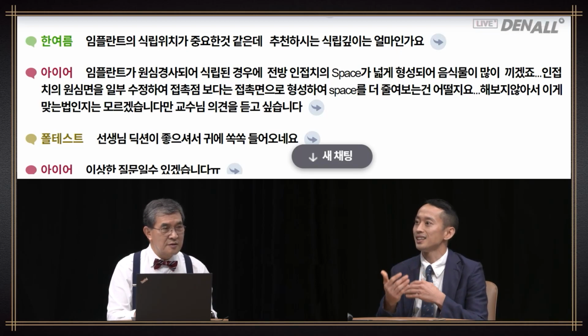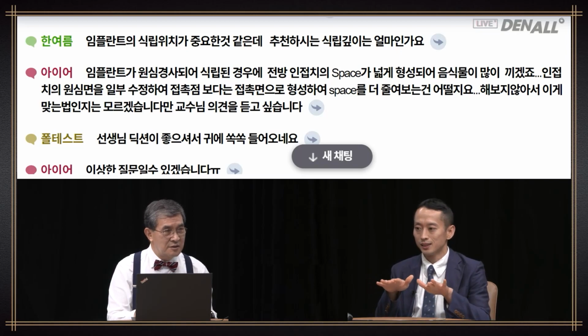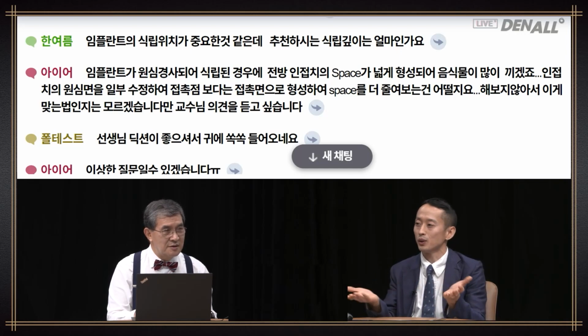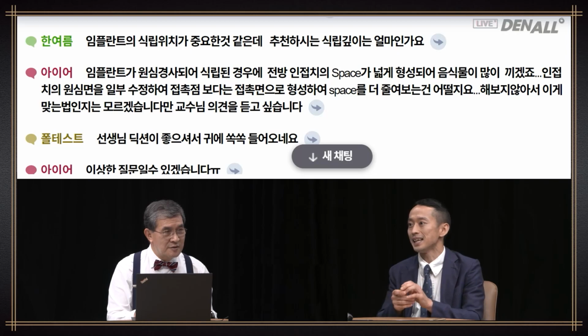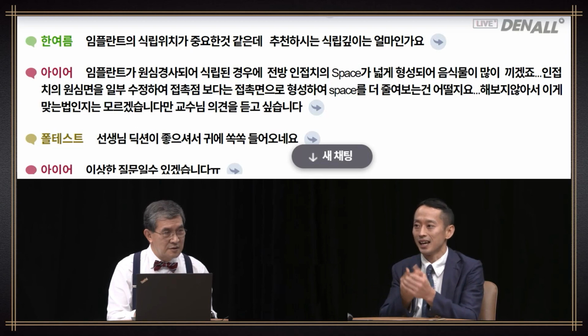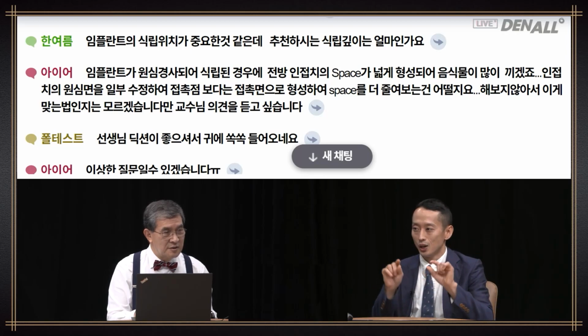Platform switching is possible these days, and resorption does not occur inferiorly to the implant. Even if you place the implant, bone loss does not occur significantly. A lot of our predecessors recommend placing the implant deep.